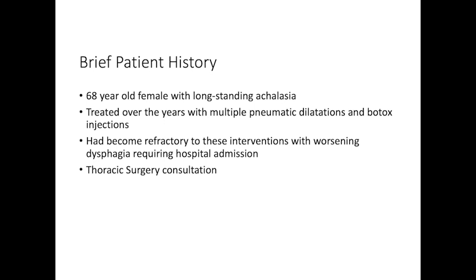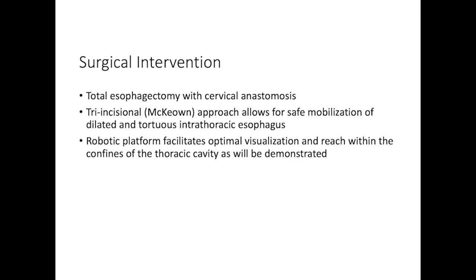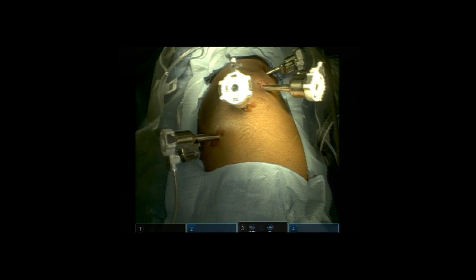Here are the coronal and sagittal CT scan images, and you can appreciate the chronically dilated esophagus. Following a detailed evaluation, the decision was made to proceed with total esophagectomy using the robotic platform. Thoracic port placement is shown. We utilize 4 robotic ports and a 15mm assistant port.